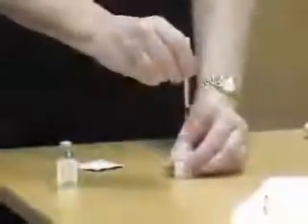And I'm going to wipe off both sides. And then I'm going to draw up how much air I need for NPH and put that in this way, not this way, because I don't want to contaminate my needle. I put the air in, come out, right? Get more air, 4 units, I believe. Put it in, then flip it over, right?